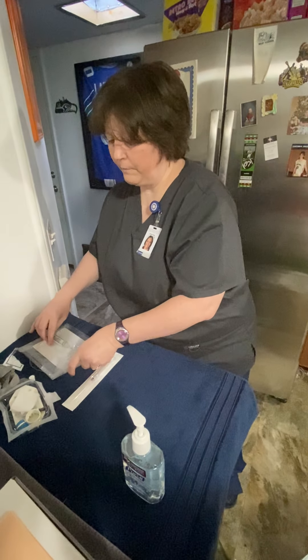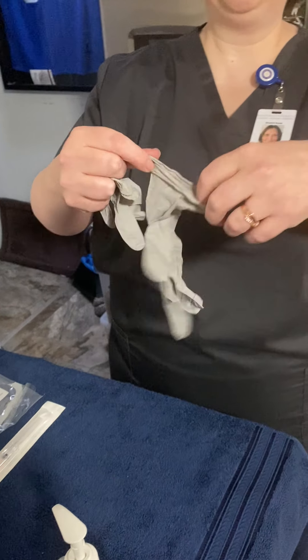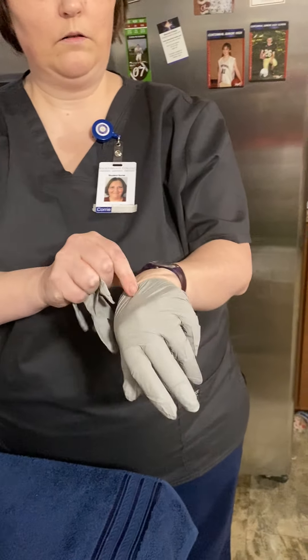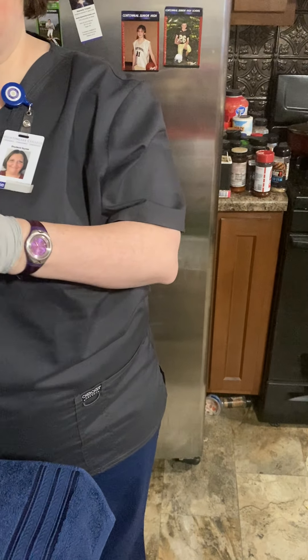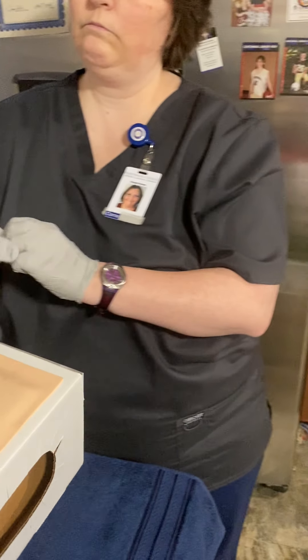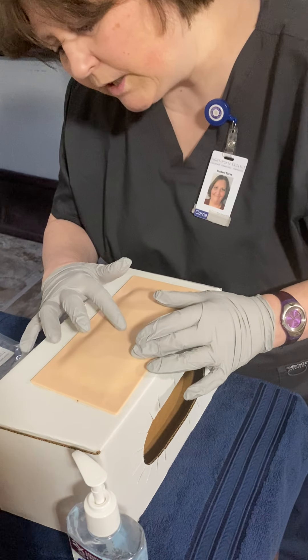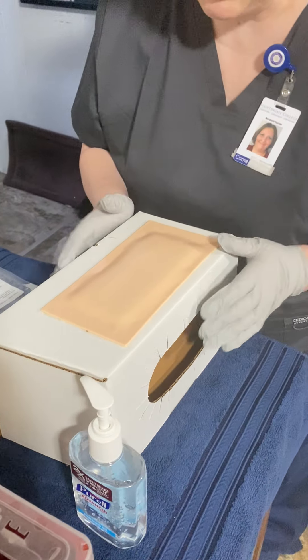I'm going to place that right there. Now the next thing I'm going to do is put my gloves on. Okay, so I have a really good vein right here that I think I'm going to use — it feels really good.